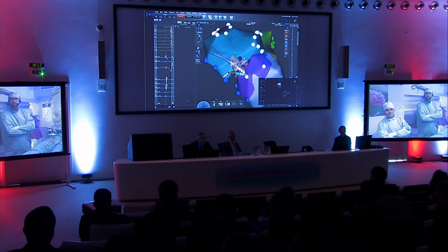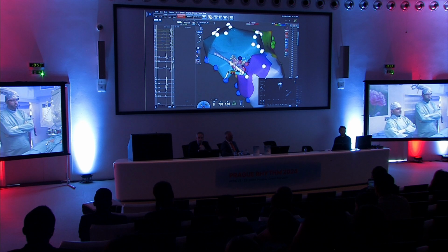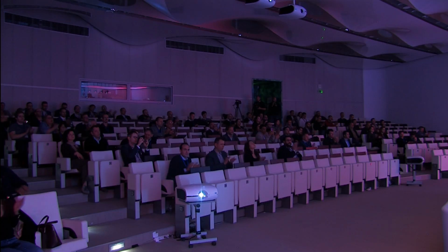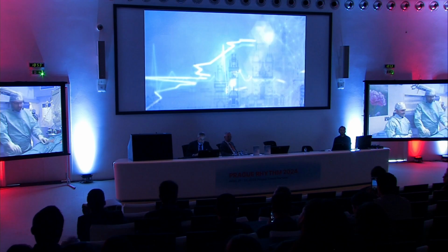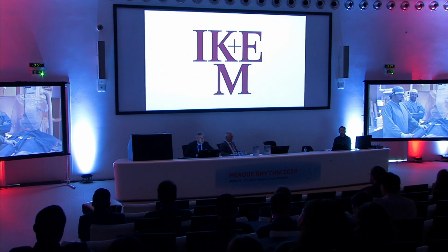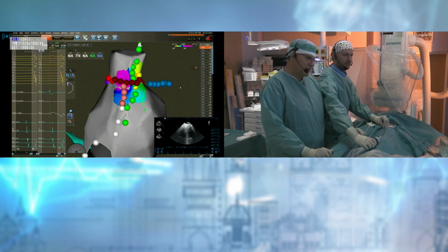Any more questions? If not, I think we would like to thank you, Roman and Drag, for a nice demonstration of this neuroablation for an AV nodal functional problem. And thanks. So now we will move to the lab where Dan does this modification of the right atrium for inappropriate sinus tachycardia using pulsed field from a solid tip catheter.